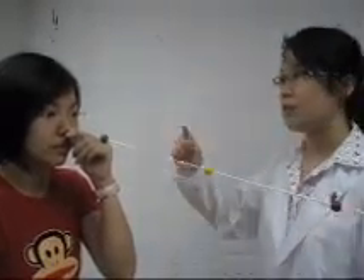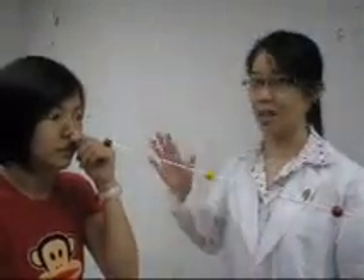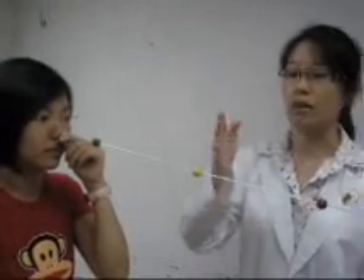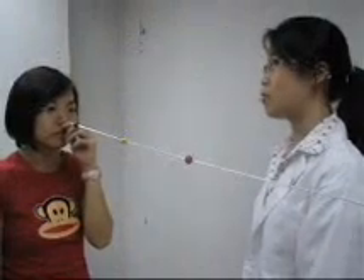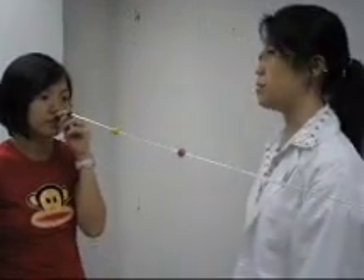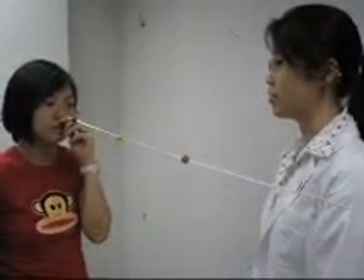This patient comes back for her follow-up convergence vision therapy at a closer distance. The distance between the nose and the green bead is 10 cm. The distance between the green bead and the yellow bead is 25 cm, and the distance between the yellow bead and the red bead is 25 cm. Now I'm going to train the ability of the eyes to converge and appreciate physiological diplopia. Please follow my instructions on which bead to focus at and tell me what pattern you see.